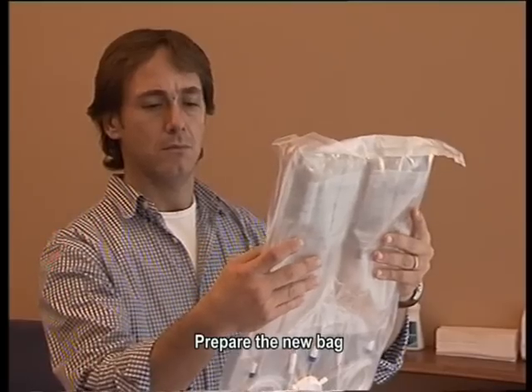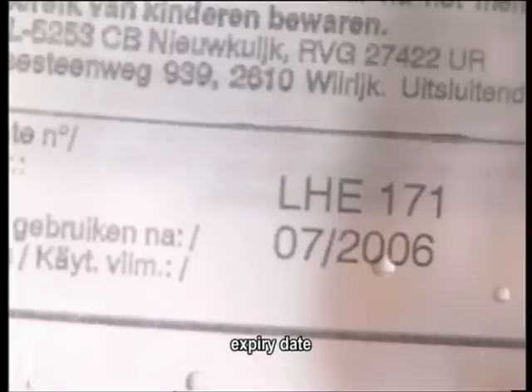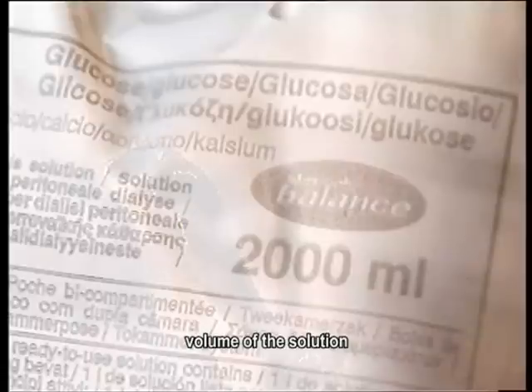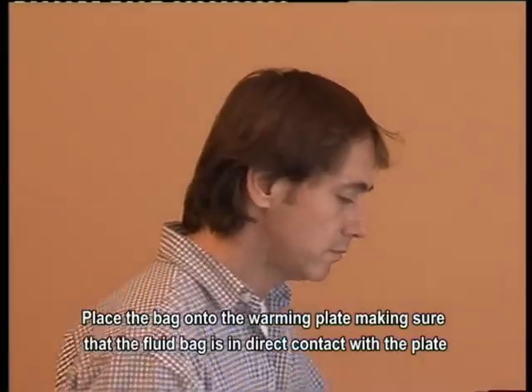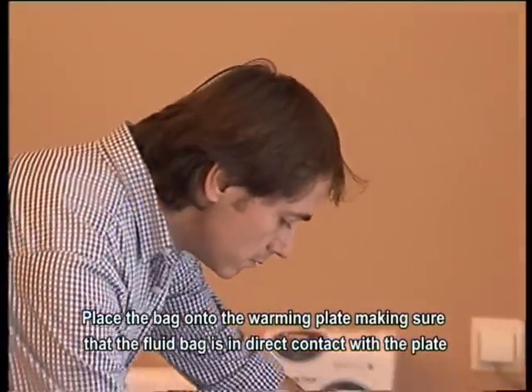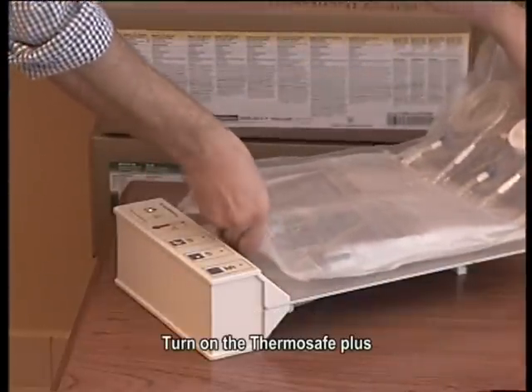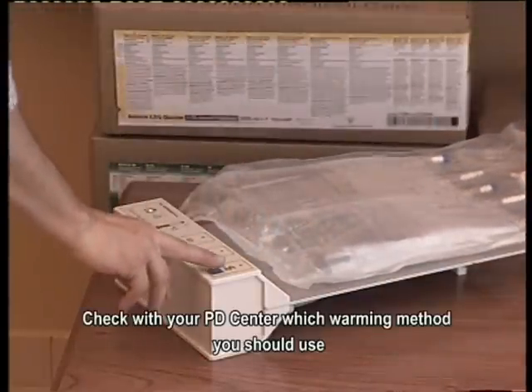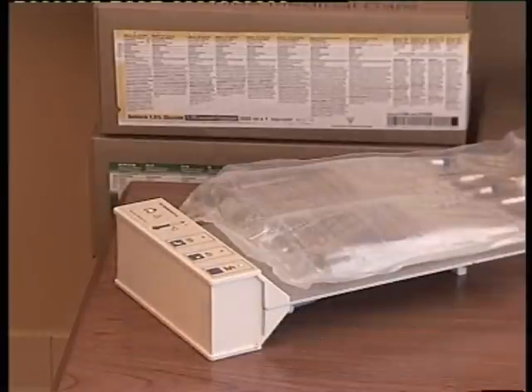Prepare the new bag. Check the glucose concentration, expiry date, volume of the solution, and make sure that the outer wrapping is not damaged. Place the bag onto the warming plate, making sure that the fluid bag is in direct contact with the plate. Turn on the ThermoSafe Plus. Check with your PD center which warming method you should use.